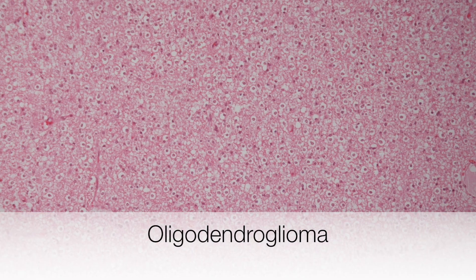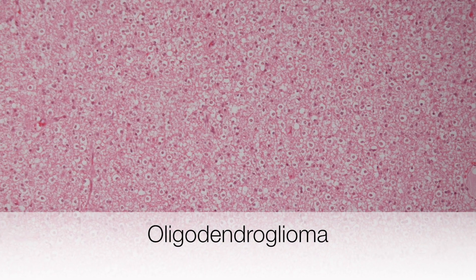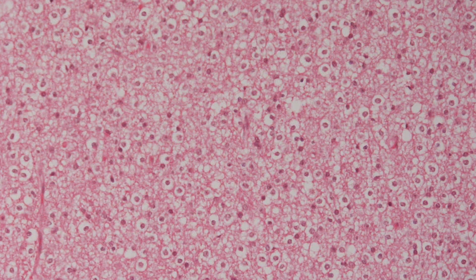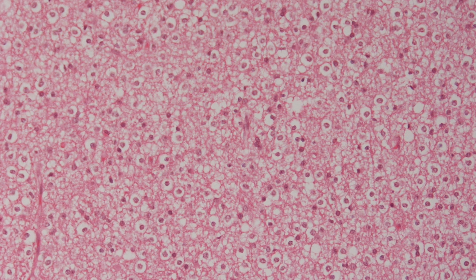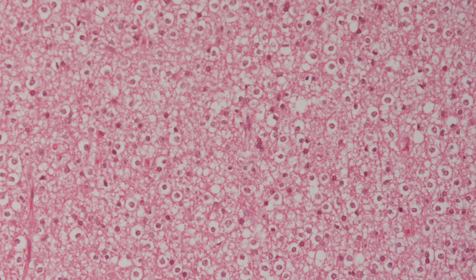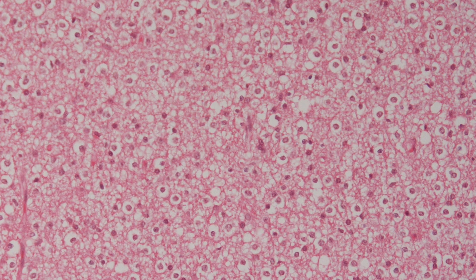Here is the typical histological appearance of a grade 2 oligodendroglioma. It is composed of sheets of regular cells, and even on low power the perinuclear halos can be seen, producing a fried egg type of appearance. On higher magnification, the typical fried egg appearance of the cells in the oligodendroglioma can be appreciated.